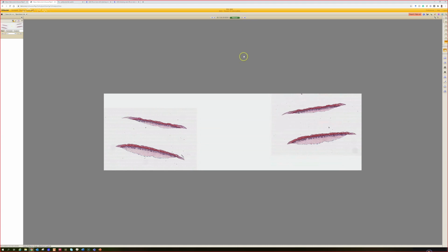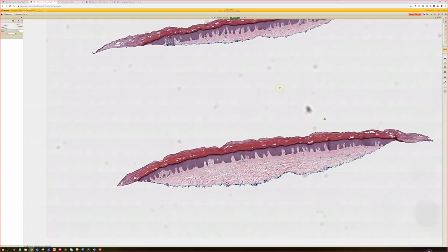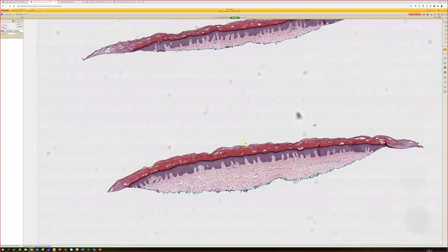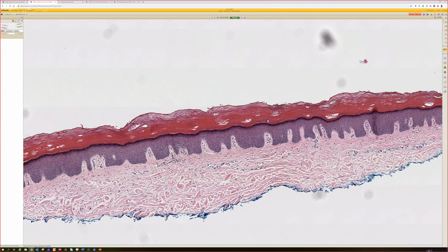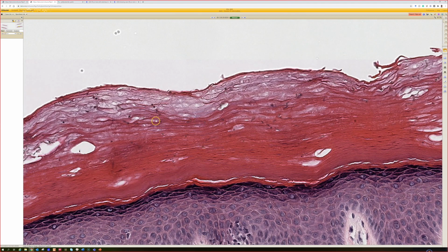Okay, what's this one? Acral skin. Looks like normal almost, doesn't it? So this was just like what you said, acral skin with normal skin, but in the stratum corneum there were pigmented hyphae. Good. There they are.